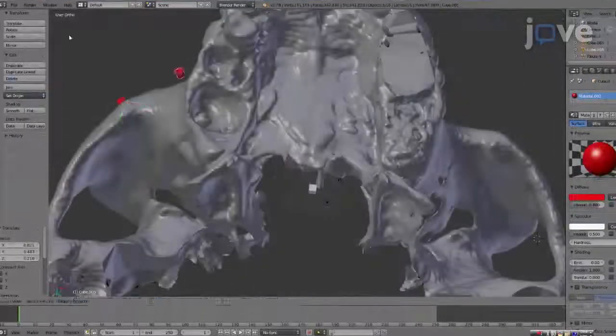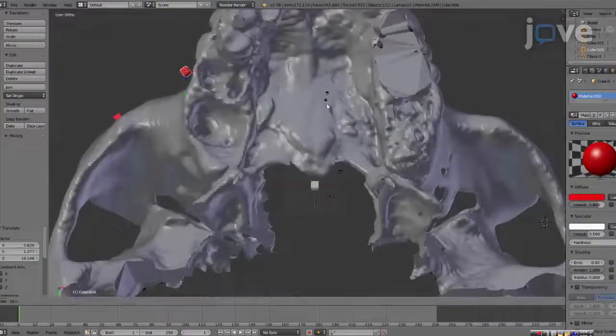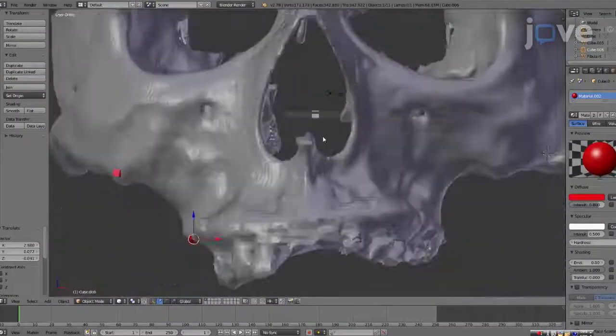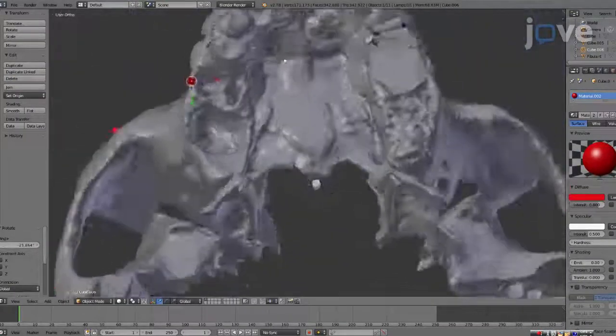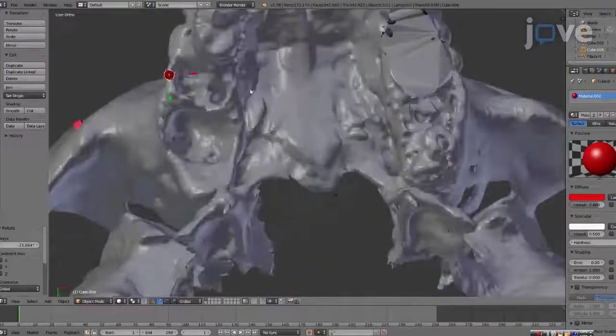For the maxilla, place red cubes for the identification of the reconstructed points.